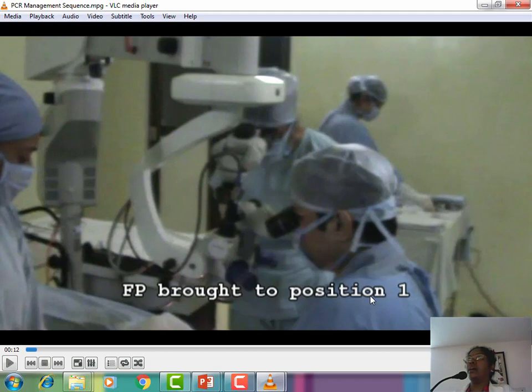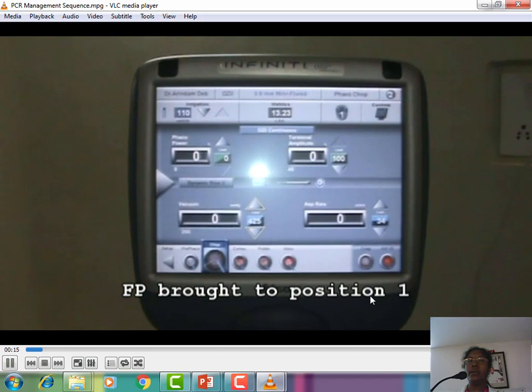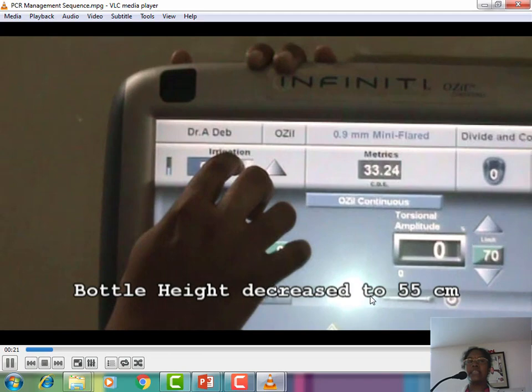If the patient is under topical anesthesia, convert to sub-Tenon's or local anesthesia to relieve pain — if there is a PCR and the patient squeezes the eye, further problems will occur. Make sure both the patient and your assistant are comfortable for a complete and successful vitrectomy. Bring foot pedal to position 1, use dispersive viscoelastic like viscoat to plug the PCR, then lower the bottle height.